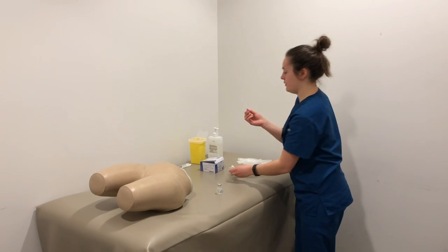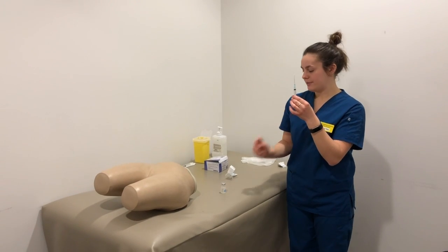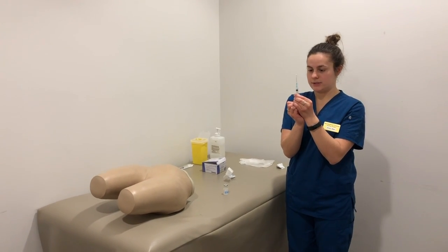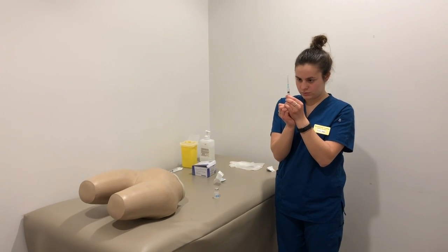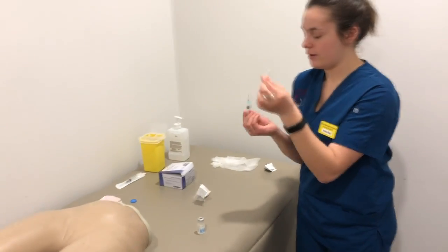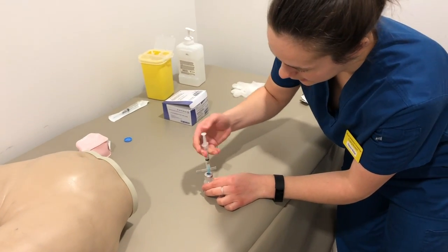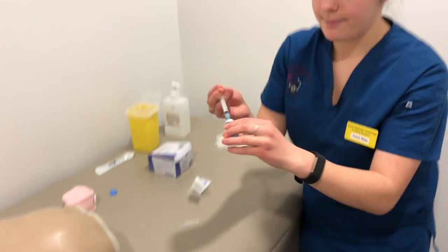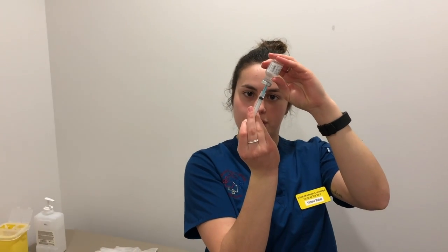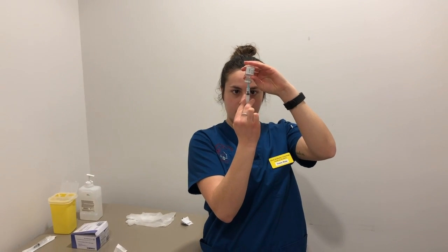So I'm going to be pulling the needle out. I'm going to pull back on the syringe because you need to inject air into the vial. So I'm going to be pulling back to 1 ml, which is what I need to inject into Mr. Mancini. So I'm going to take the sheath off and inject into the vial. I'm going to inject the air in and then tip back, and using the pressure will generally bring back the medication that you need, but you can guide it with your thumb as needed.